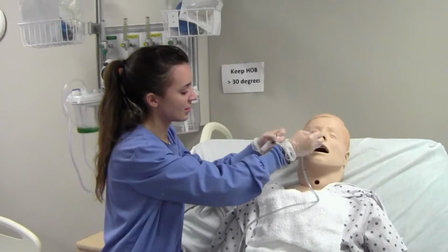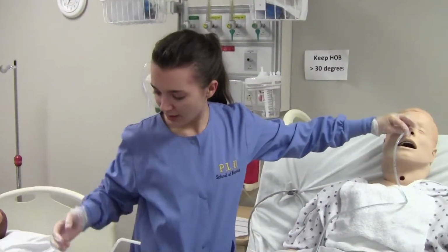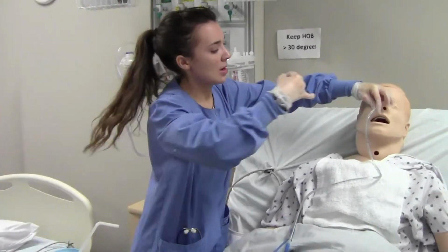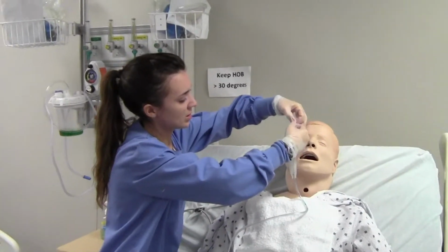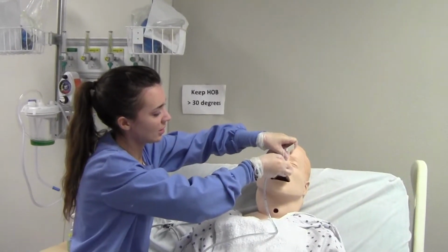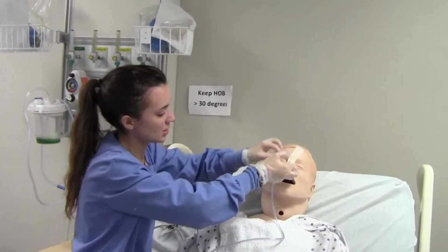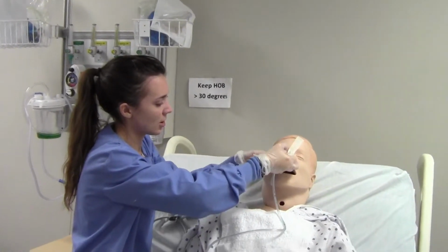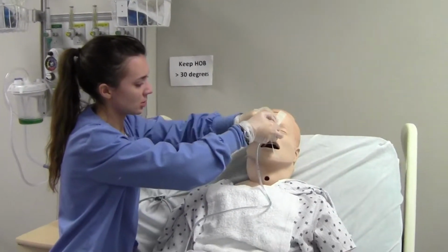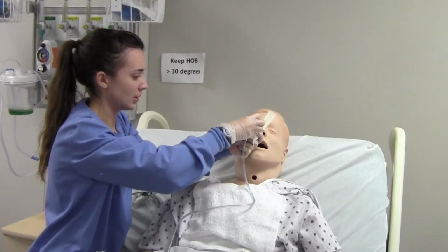Okay, perfect. Great job of holding still with me, Mr. Templeton. You're doing wonderful. Okay, and this tape is going to help us keep it nice and secure on so it doesn't move at all anywhere. I'm going to make sure it doesn't bug your nose at all, or your nares, your nostrils. Make sure it's not too close up, but it's nice and flush.